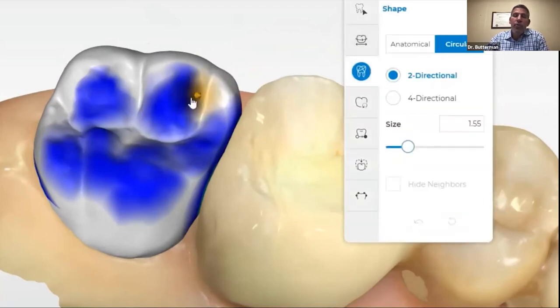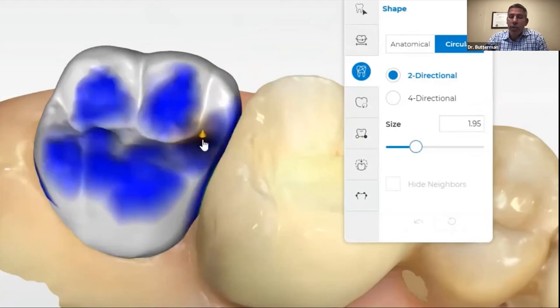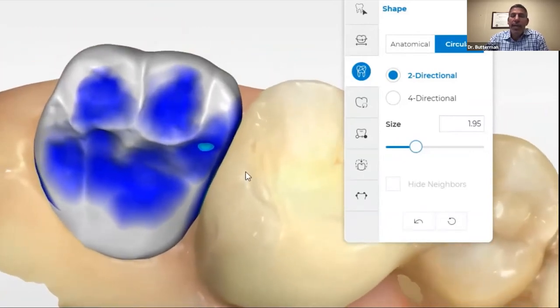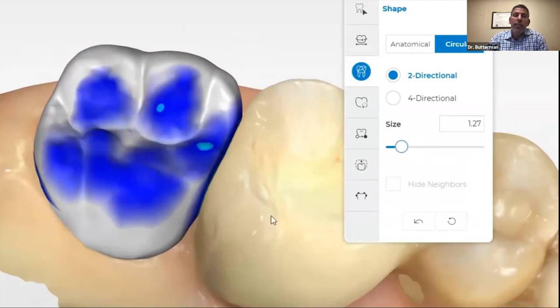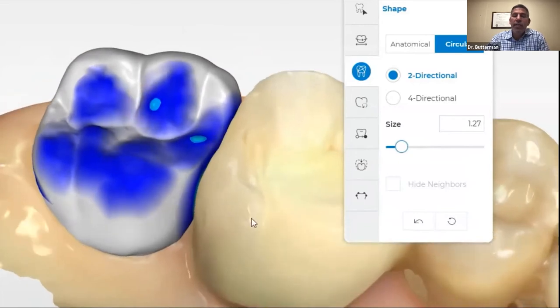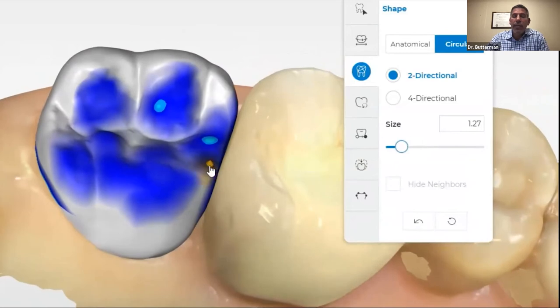Now, if you do double turquoise, so you've got two layers, now we have dark blue. Dark blue is out of occlusion. Once you start going to this double, two layers of that light blue, or what I call double turquoise, now you're going to start to get an articulating paper mark. So we want to build that onto the mesial marginal ridge, and I want to build that onto the distal incline of that cusp. Just those two marks, that's what you're going to have, articulating paper mark there. That's what's going to hold that into place.